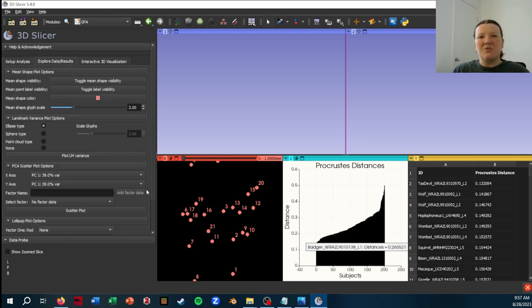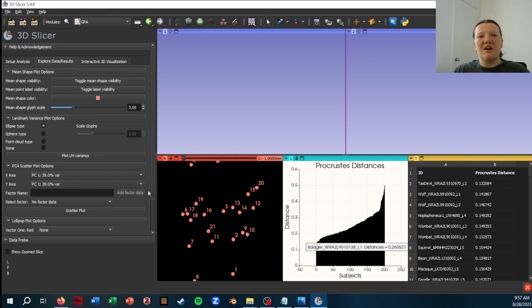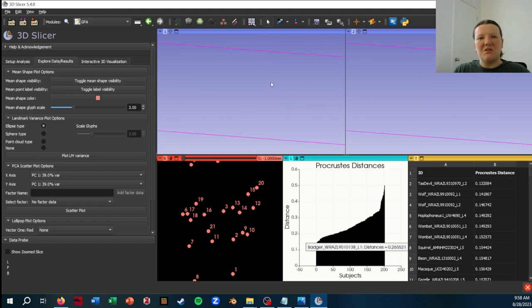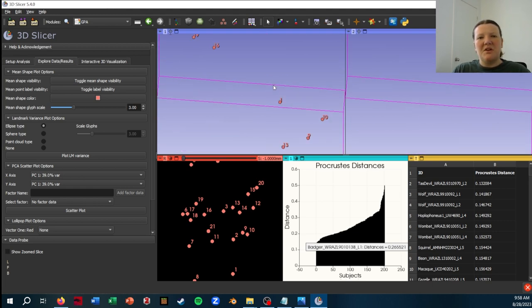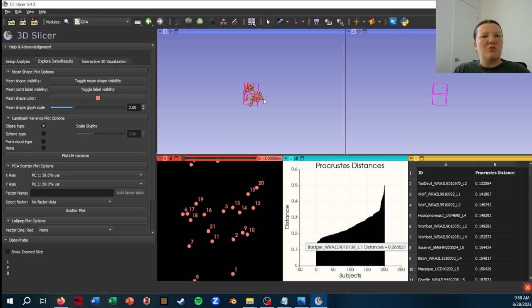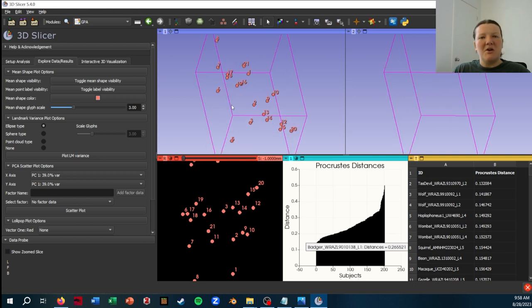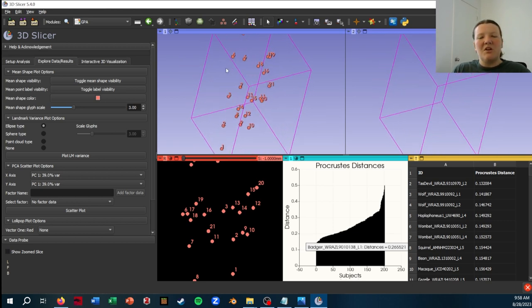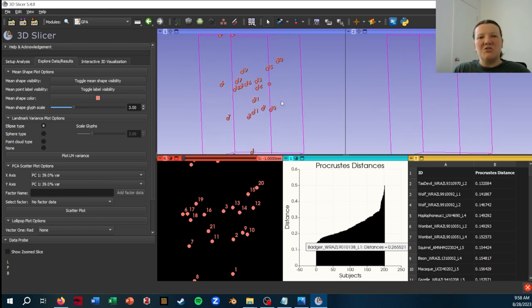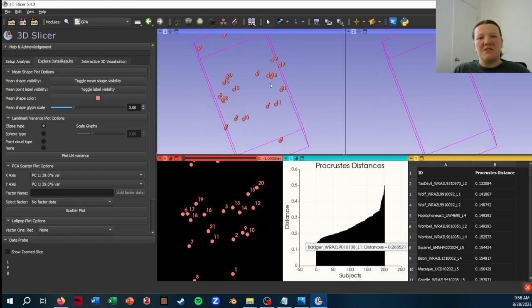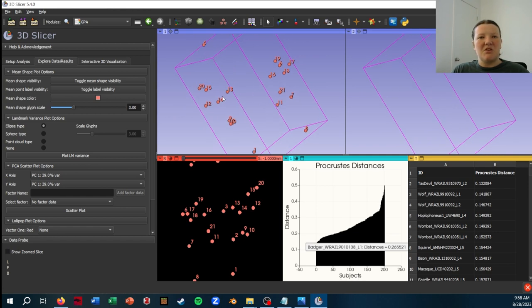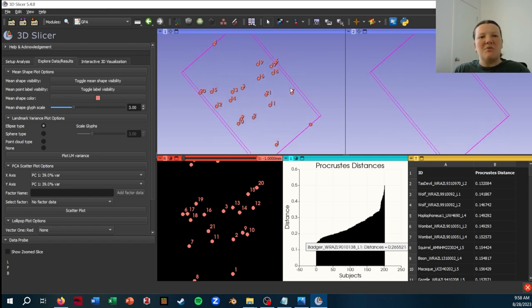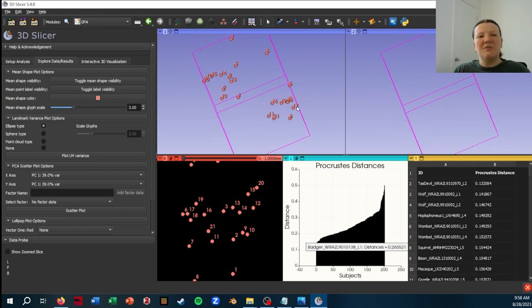If you go to this Explore Data / Results tab, what you may not realize right away is that there is a mean shape being visualized in this 3D viewer here. It just, for some reason, always starts really zoomed in. So I generally have to move it a little bit and then use my scroll wheel to zoom out. But here you can see the mean shape represented as this cluster of points with each landmark labeled.